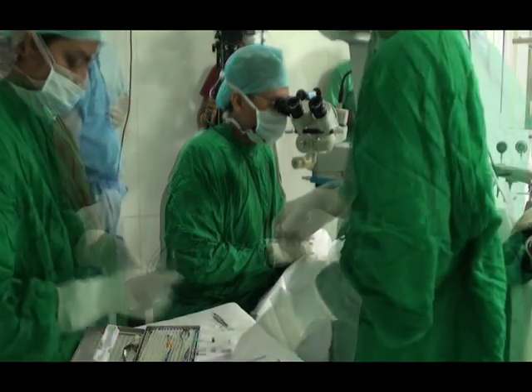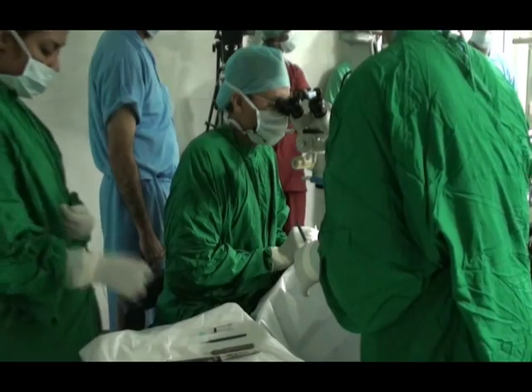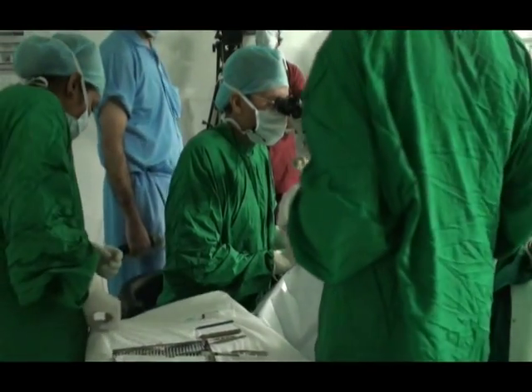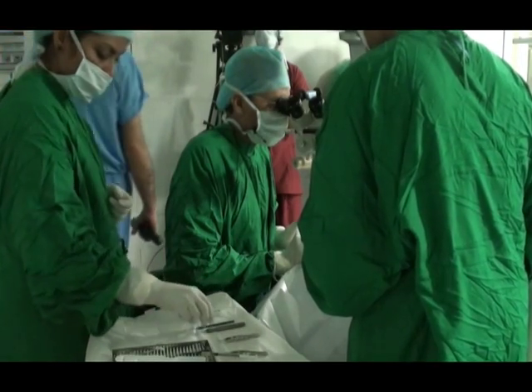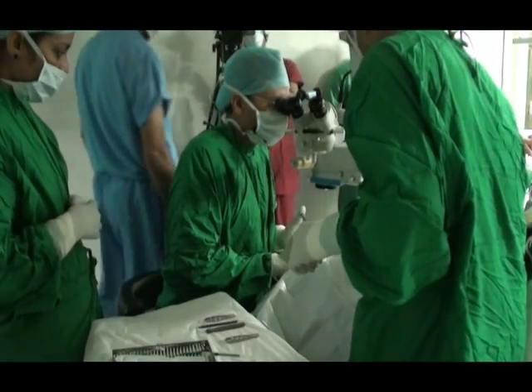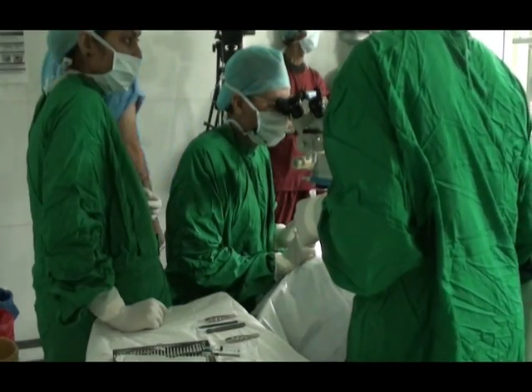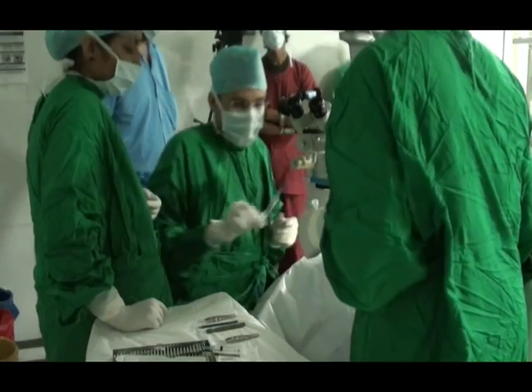This is the Bonn capsular forceps with the Utrata capsulorrhexis forceps. This is approximately a 5.5 mm capsular opening. I make a little pressure on the posterior lip to allow egress of the viscoelastic. I go underneath the capsule and lift it, and then just inject a little amount of fluid at multiple quadrants. This allows achieving a good hydrodissection.